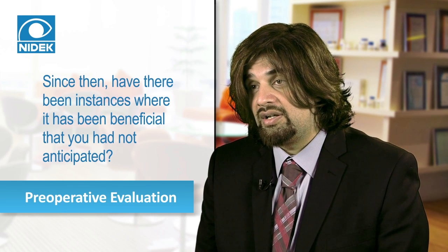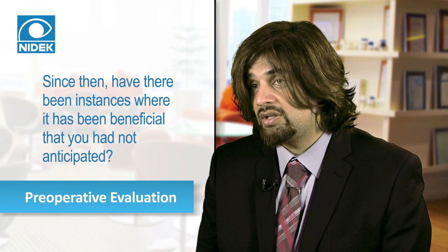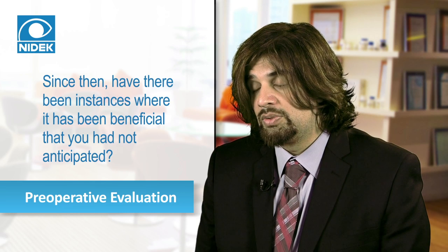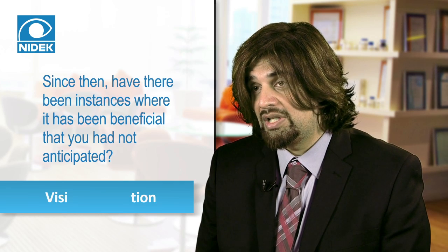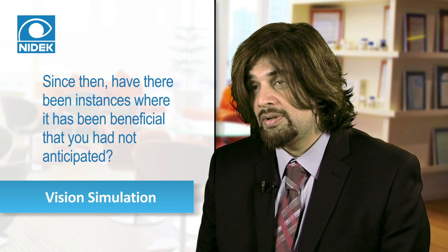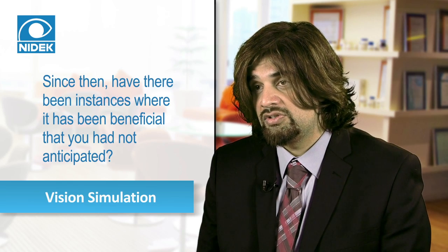Being able to look at line of sight and look at pupillary centration can also help in terms of determination of angle kappa. IOL centration is, again, something we feel is quite important for aspheric lenses and multifocal lenses, being able to evaluate this preoperatively. So really being able to be prepared ahead of time before going to surgery gives us the most tools to select our patients. We also really like the ability to show patients the value, for example, using simulation of some of the products that we may be using in the eye, to show a patient the difference between aspheric lenses and toric evaluation as well.